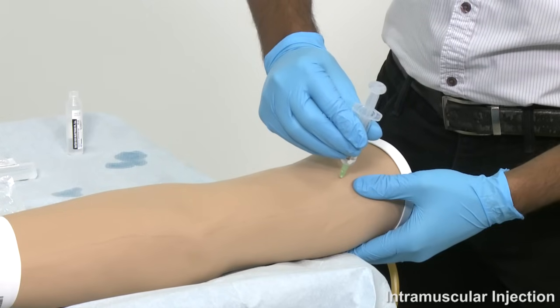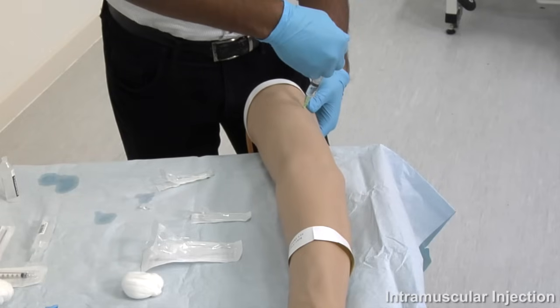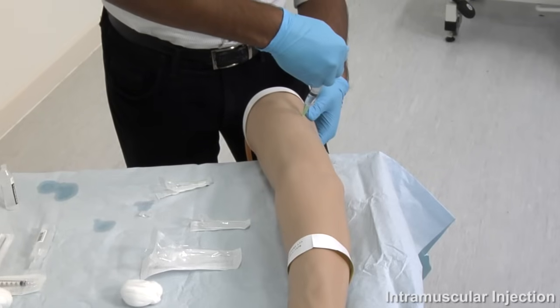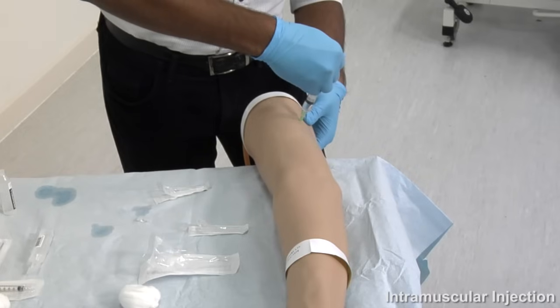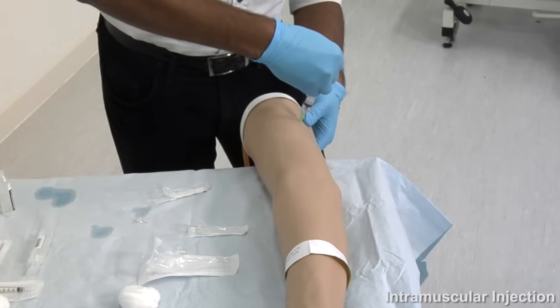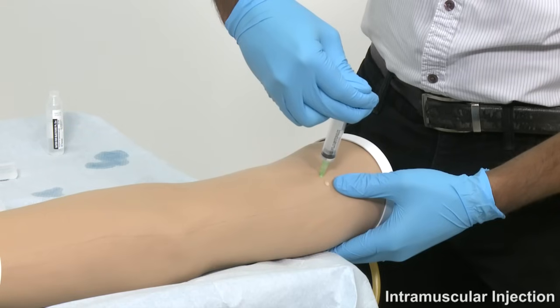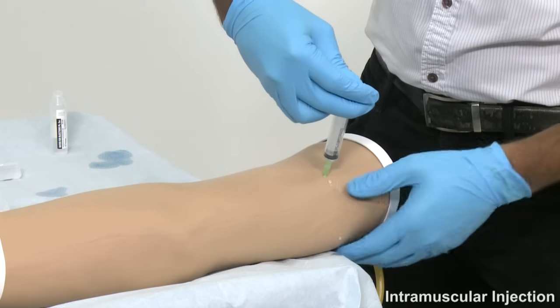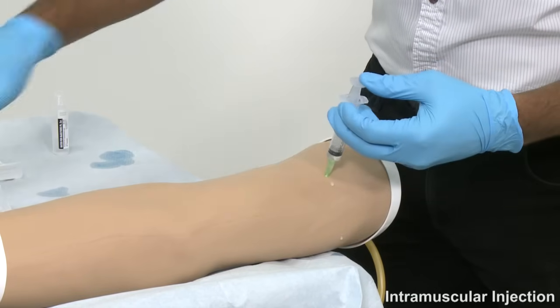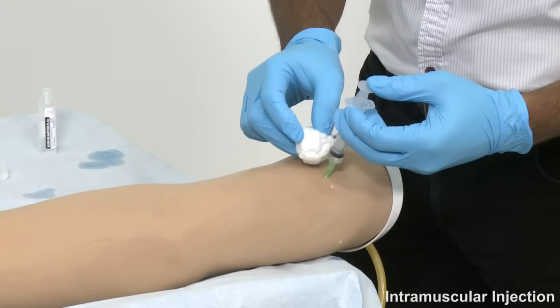Draw back on the plunger slightly to ensure that you have not entered a blood vessel. When you are confident that you are in the musculature, proceed to delivering the drug. For a large volume, wait several seconds before withdrawing the needle. Once you have withdrawn, apply pressure with the cotton wool ball and dispose of the sharp immediately.